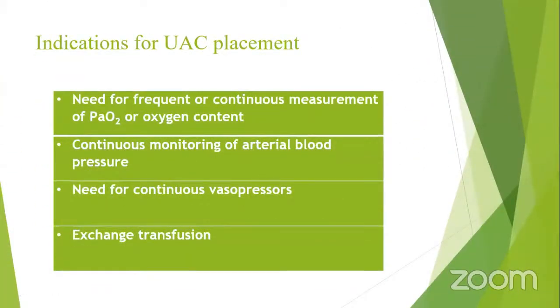Indication for UAC placement: need for frequent or continuous measurement of PaO2 or oxygen content, continuous monitoring of arterial blood pressure, and need for continuous vasopressor or exchange transfusion.